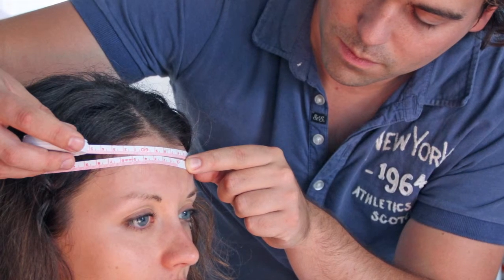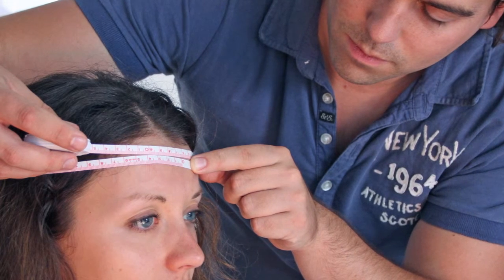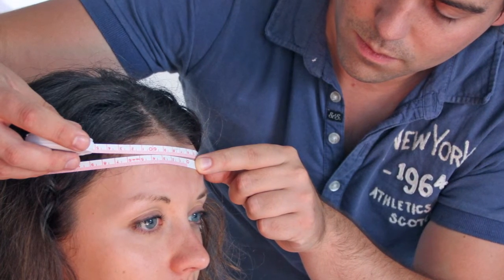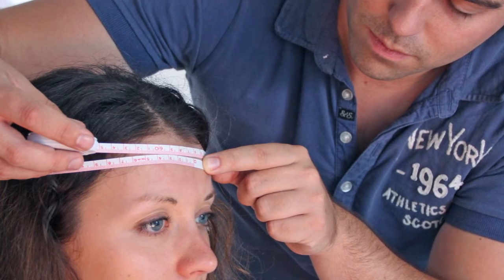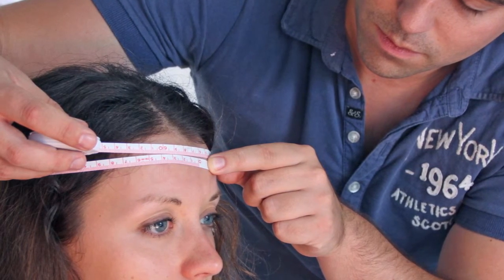Measure the patient's head circumference around the widest point of the head using a flexible tape measure. Cap sizes are given in centimeters, so be sure that a metric tape measure is used.